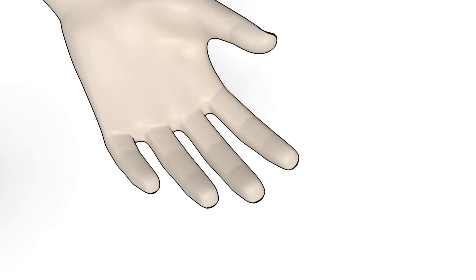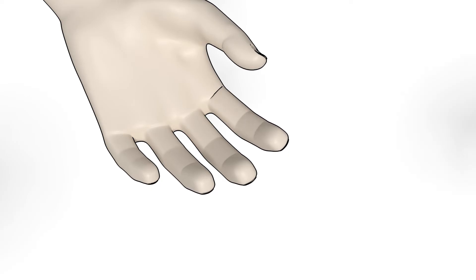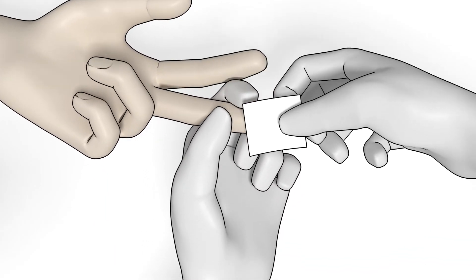Make sure the patient's hand is warm and relaxed. Use the middle or ring finger for sampling. Clean the fingertip with disinfectant and let it dry.